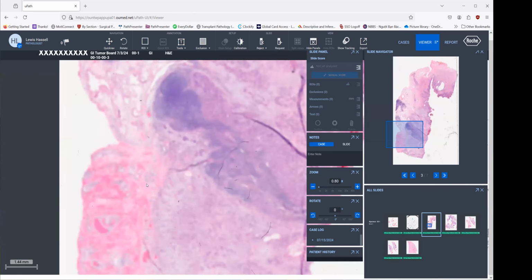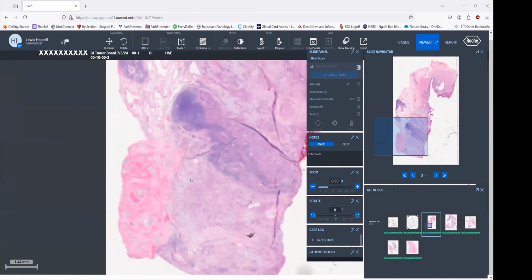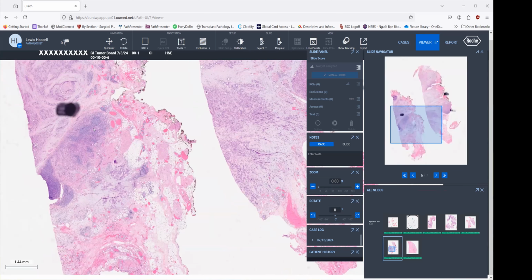So here we had reaction to the surgery with fibrin and tumor right here. So this was reported as positive. And so then they went back and resected more tissue, the superior mesenteric artery tissue, and provided this additional tissue, which again showed tumor quite close to the margin.